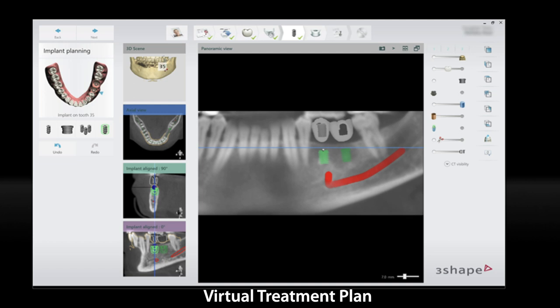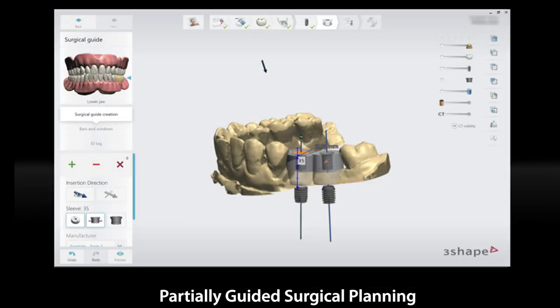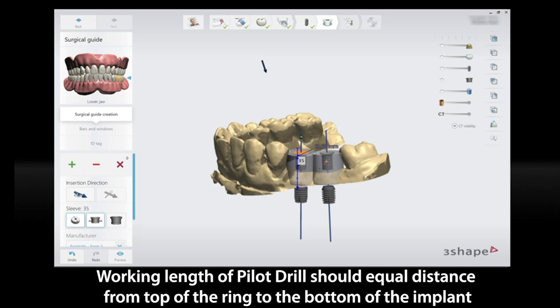Since we are planning for a partially guided protocol using a pilot drill, we need to adjust the offset distance to be consistent with the pilot drill that you have. So here, the offset distance is the distance between the top of the ring and the implant head. It is adjusted in this case to be 12 mm plus a 6 mm implant, so you need a pilot drill with a stopper at a length of 18 mm. The same was applied to the implant at site 3-6.